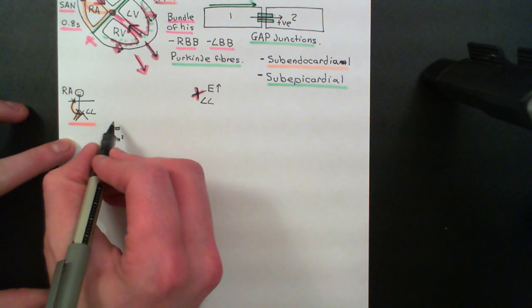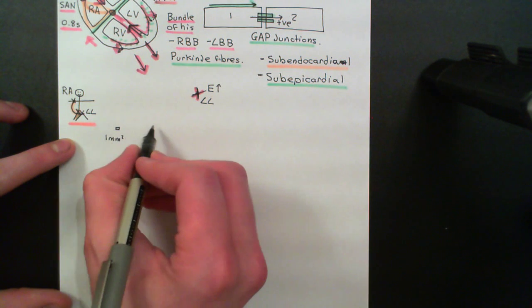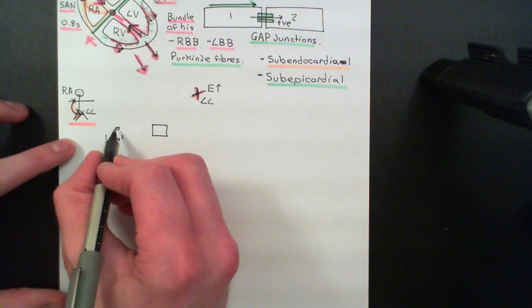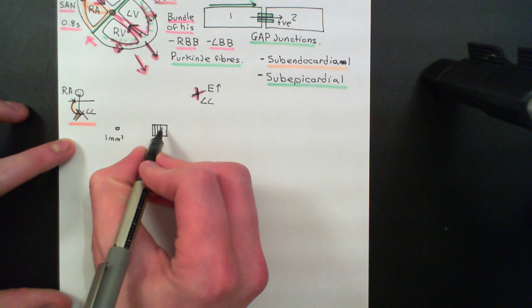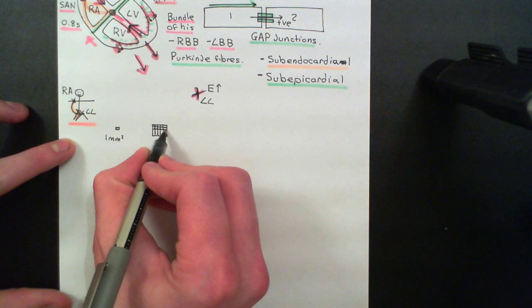Now, every 5 millimeters you have larger boxes as well. Let me draw one of these larger boxes. Not only will the paper be split into loads of these tiny boxes, but you'll also have larger boxes which contain 5 by 5 millimeter squares, like so.